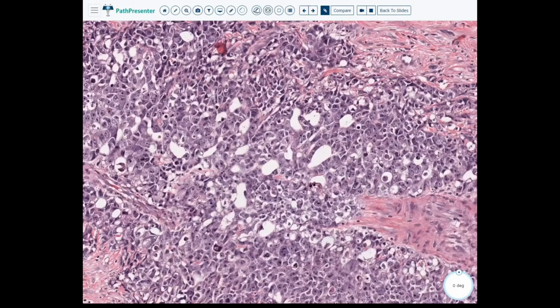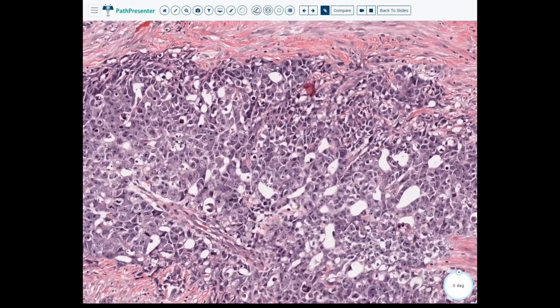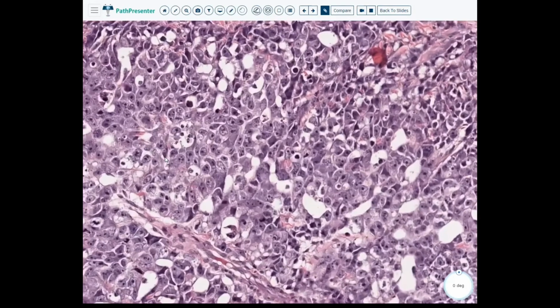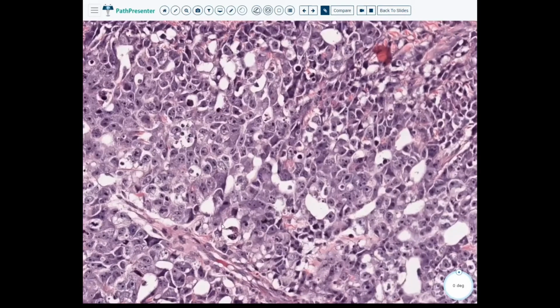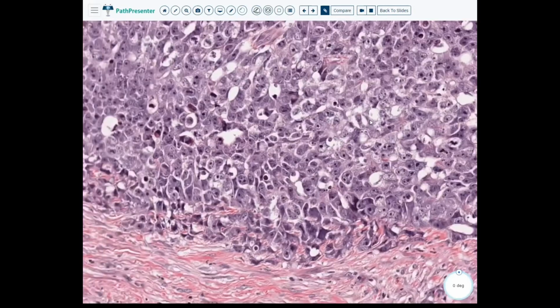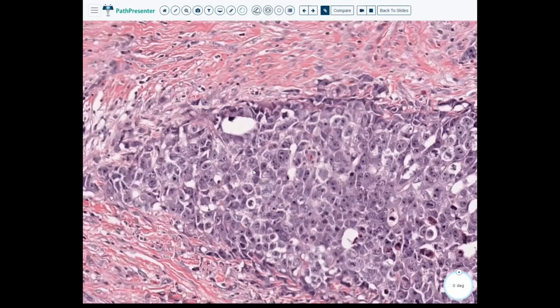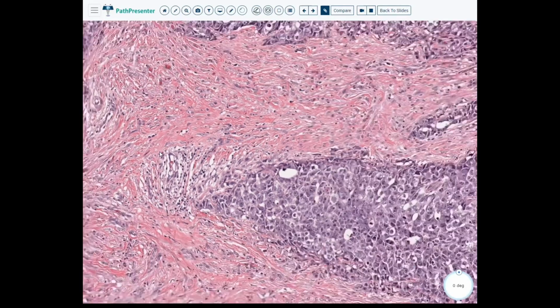These cells are quite pleomorphic. Okay. There's some apoptotic bodies kind of sprinkled all over the place. Looks like maybe that might be mitotic there. But wildly pleomorphic, so very different from what we were seeing with seminoma.